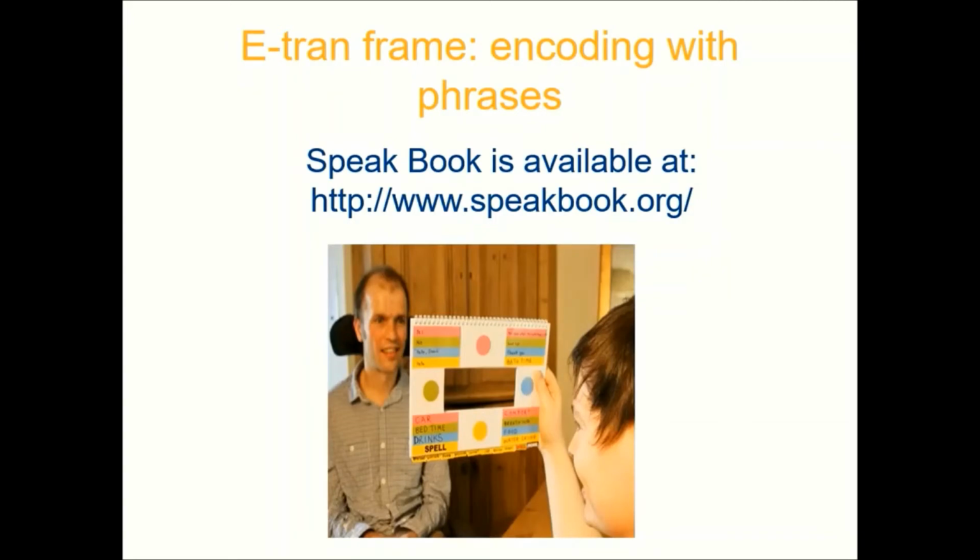And you can use eTran frames with phrases as well. So you've got an example there. This is actually a fantastic free resource. It's called a Speak Book, and it's actually a whole book of phrases that you can customize, that you can use for a client with good eye movements.